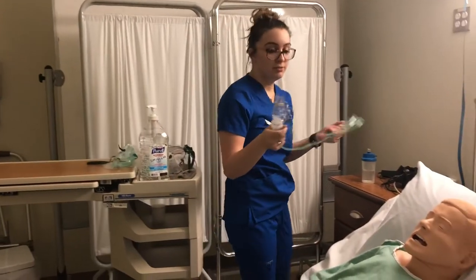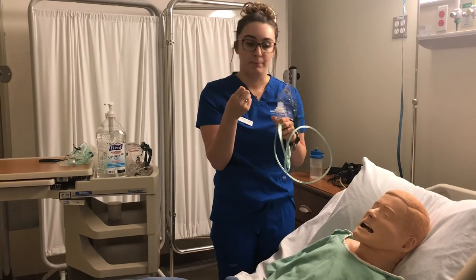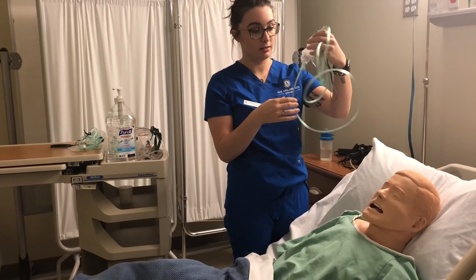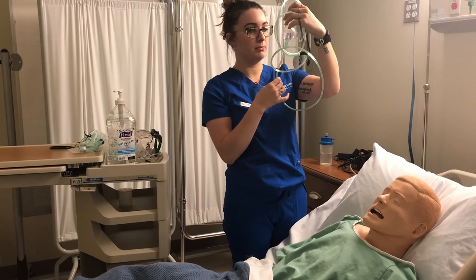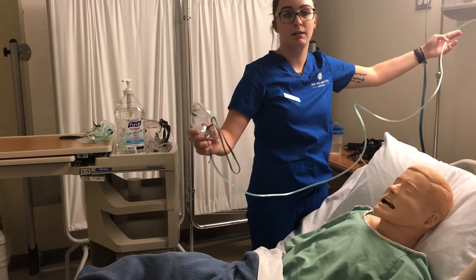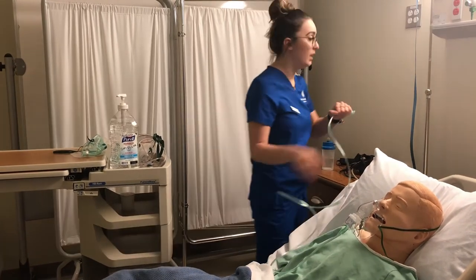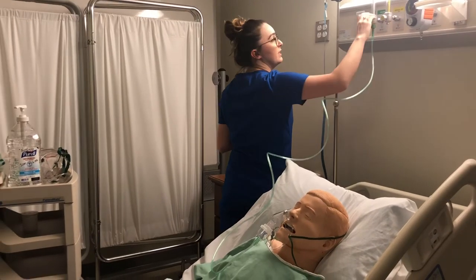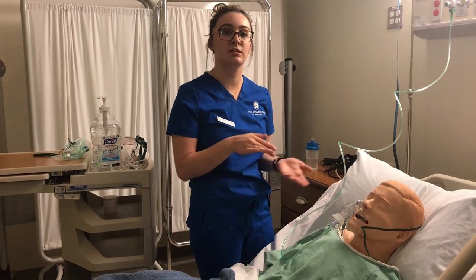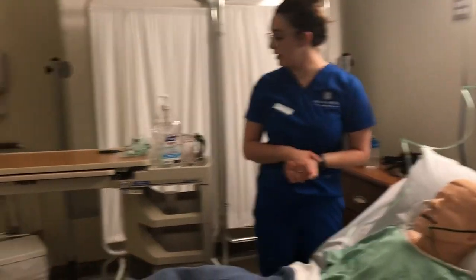Last, we have a nebulizer treatment. These can come in a mask form or a mouthpiece form — this one is a mask. You can place up to 10 cc's of medication in the nebulizer cup and set the flow meter between 8 and 10 liters. Place it on the patient at a snug fit. This creates an aerosol mist and is for medication use only — it is not used as an oxygen device. You can plug it into either air or oxygen.